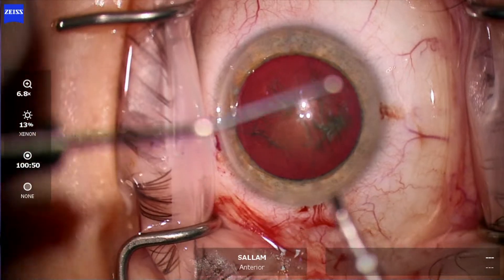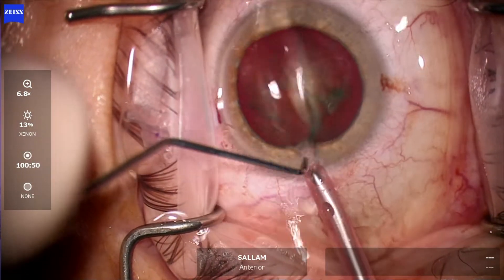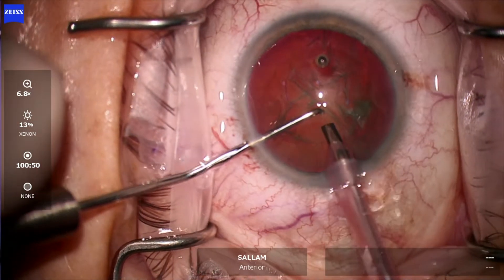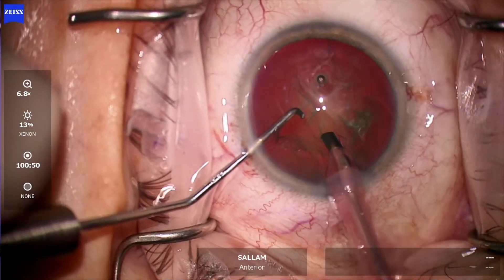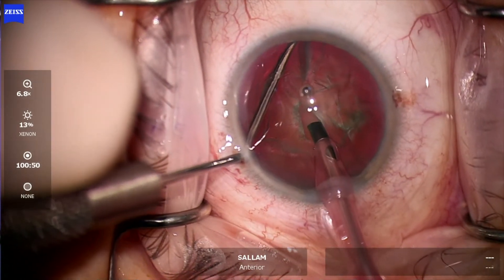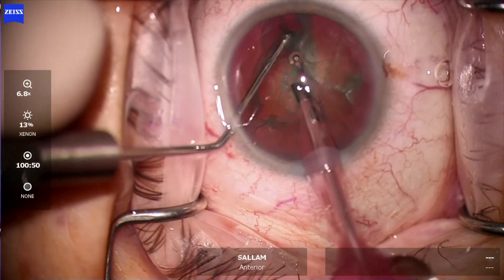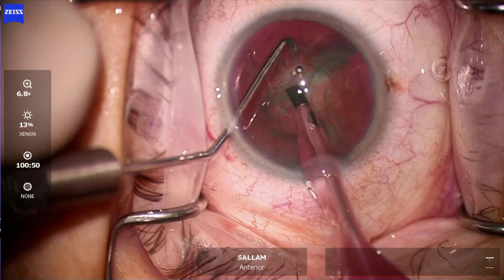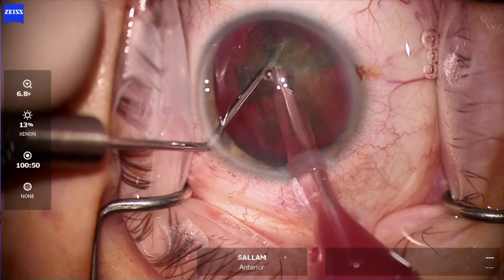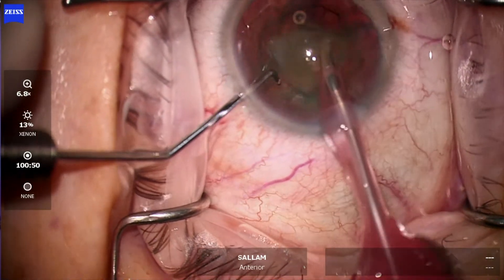Now opening the wound with the second instrument and getting the phaco in. There's a horizontal chop — scoring the lens then dividing it. Another chop here, then getting the chopped fragment out.